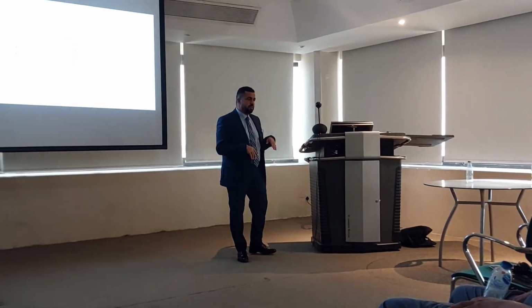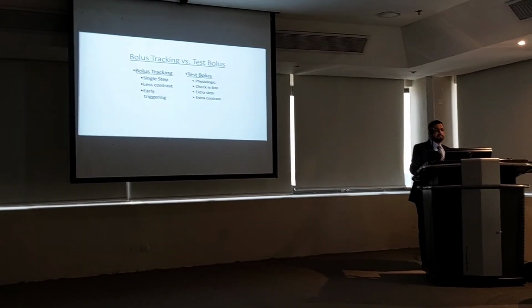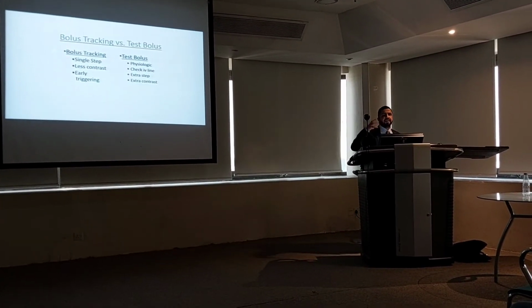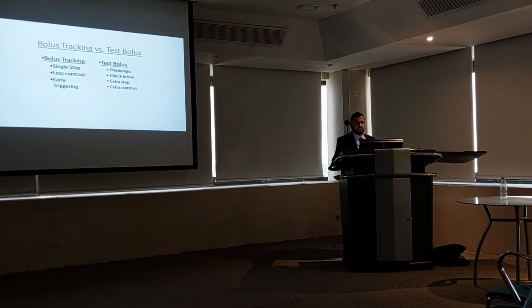I know that this is the best time to enhance the coronaries. I have no other preference. I have nothing human dependent. With SmartPrep you will find this variation, but that's just because it's physiologic, so it's really giving you the situation for this patient. That's a good time for the acquisition.